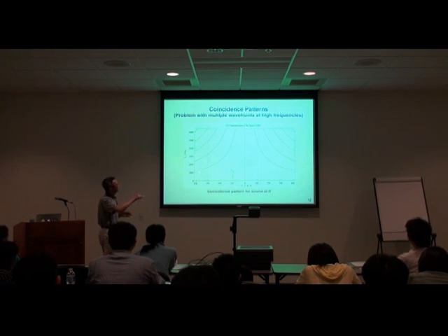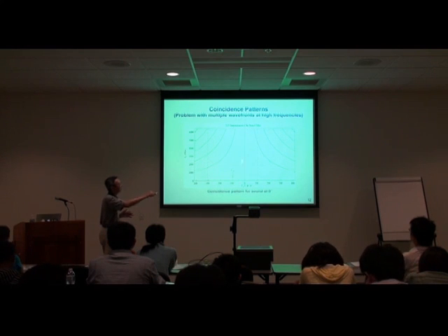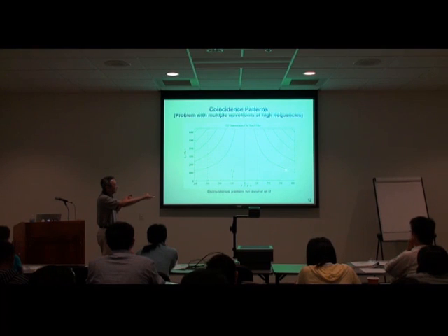But as the frequency increases, for every location, let's say the coincidence pattern for sound at 0 degree, not only do you have this coincidence here, but you also have the coincidence at the next point here, and the next one. That tells you also that the sound is at 0 degree. So you have this ambiguity.